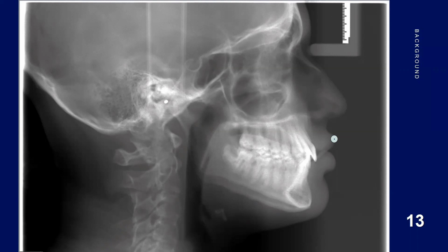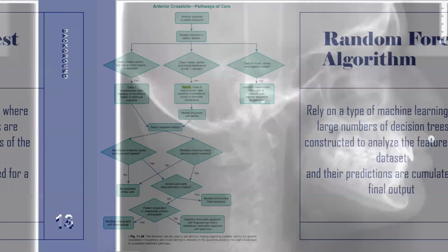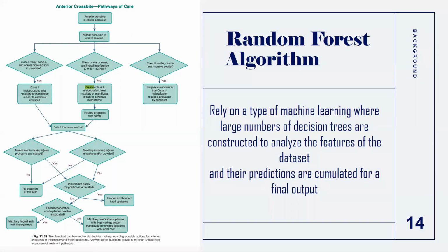millimeters. So overall, Linder and Coutts' model was able to detect the landmark 73.68% of the time within this 2 millimeter radius. And how did they accomplish this? They did this by creating a model that was based on these random forest algorithms.